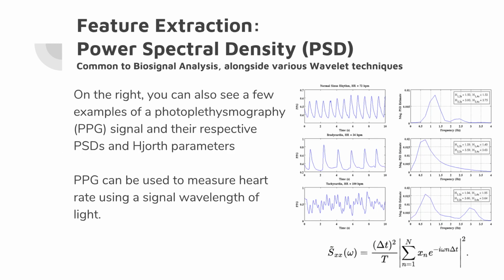So the other example of a feature that we could potentially use is called the power spectral density, or PSD. Basically, what you're doing in this case is you take the signal and decompose it into something similar to the fast Fourier transform, but not exactly the same. It effectively uses squared signals rather than the base signal. It actually turns out to be quite useful for EEG analysis. In fact, the BCI Competition 3 Set 5 data set uses PSD as its pre-extracted features, and you can get pretty high accuracy using just that.